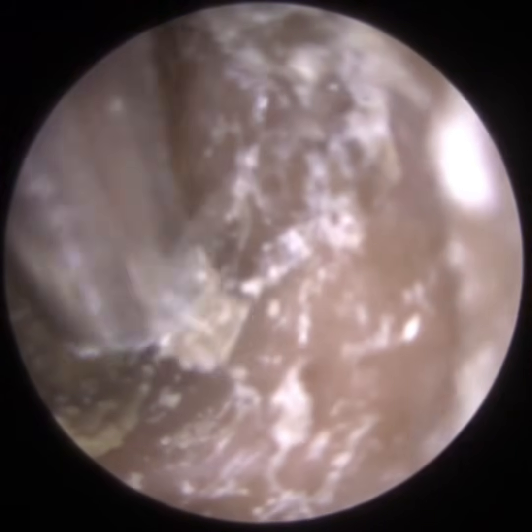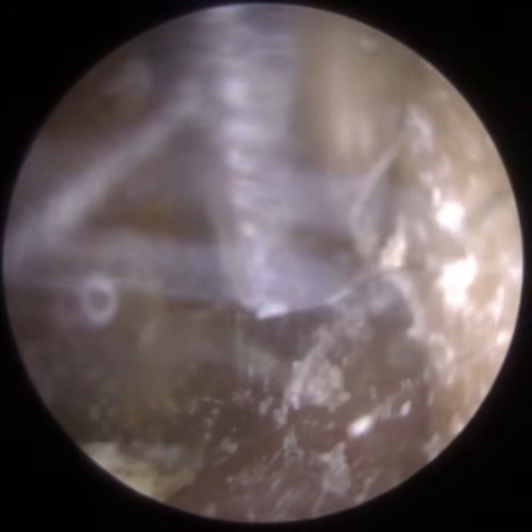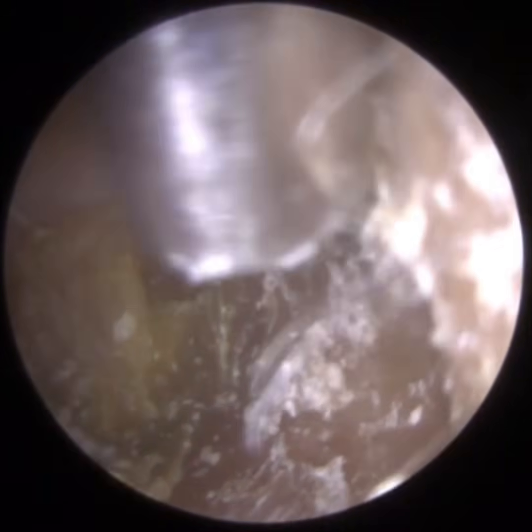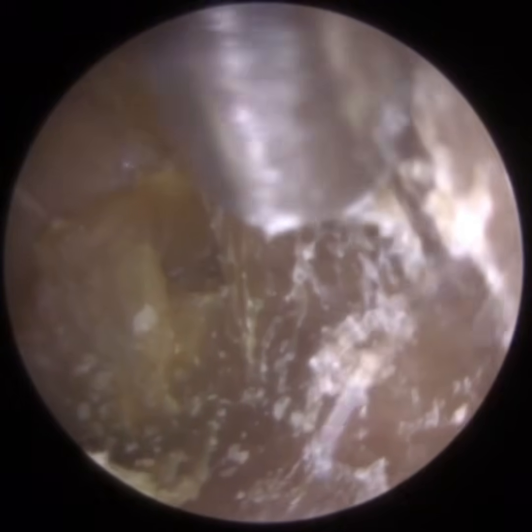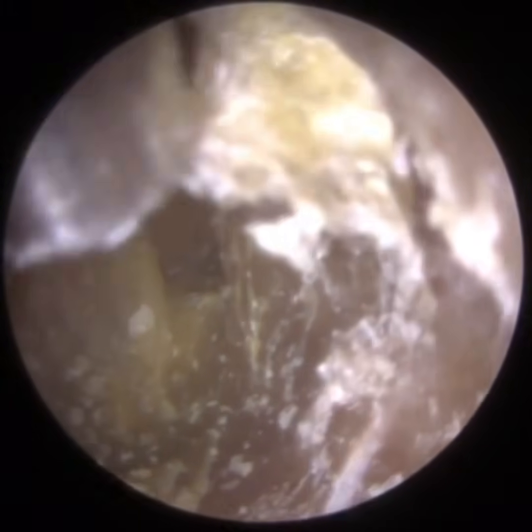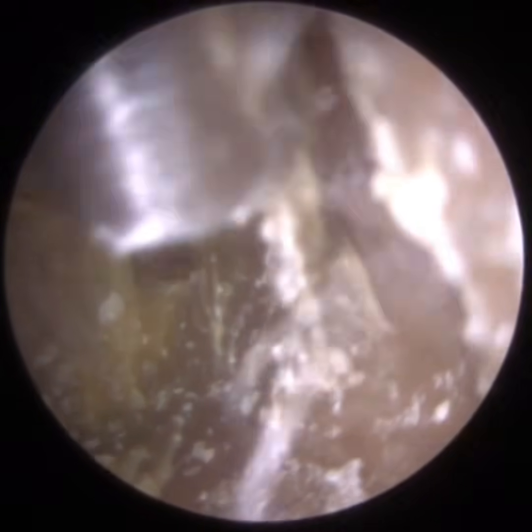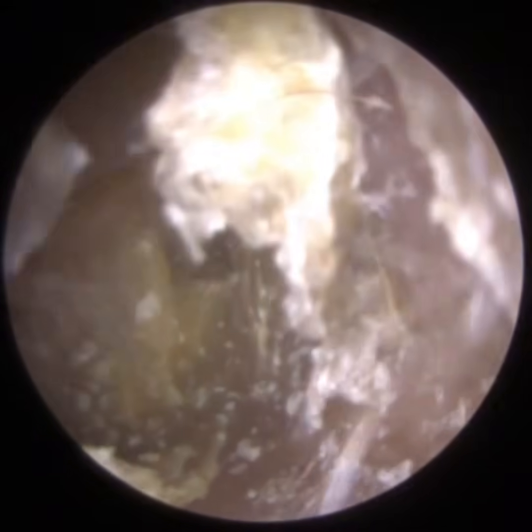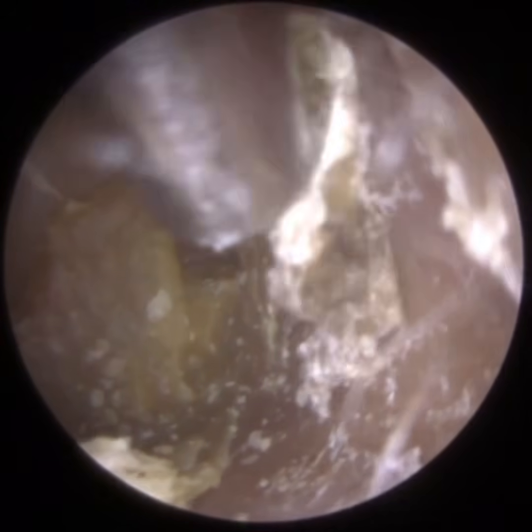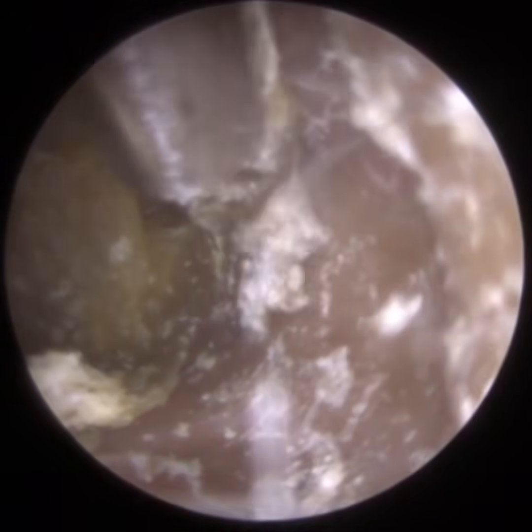So I'm just using the suction probe, trying to lift this off the canal wall. This crusted skin has adhered itself all the way around the patient's ear canal and also on the eardrum. In a moment, after I remove it, you'll see the shape of it. It's taken the shape of the patient's ear canal. It is quite tricky because it's really hardened and crusted, and I'm going to revert to forceps in a moment.